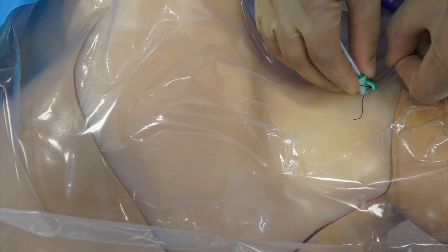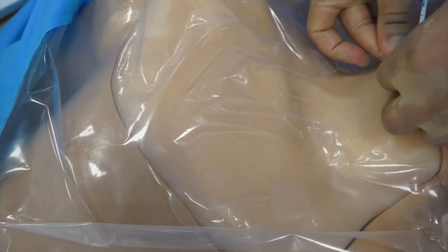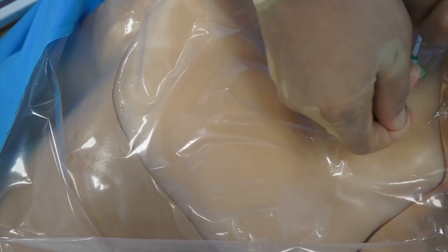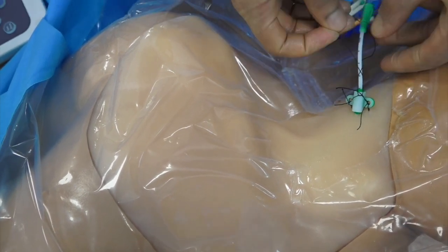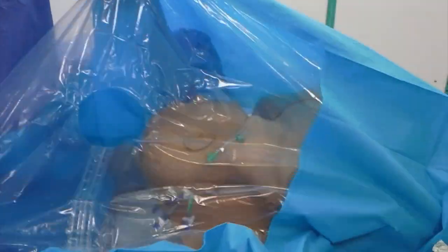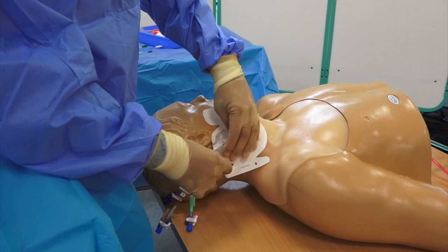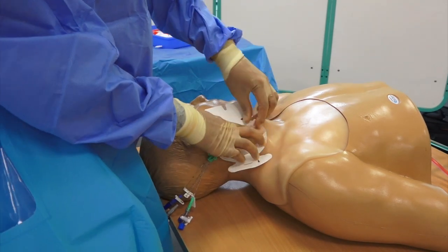Here I am performing a drain stitch to attach to the hub. Remove the sterile drape, then cover the central venous catheter with an antimicrobial impregnated central venous catheter dressing.